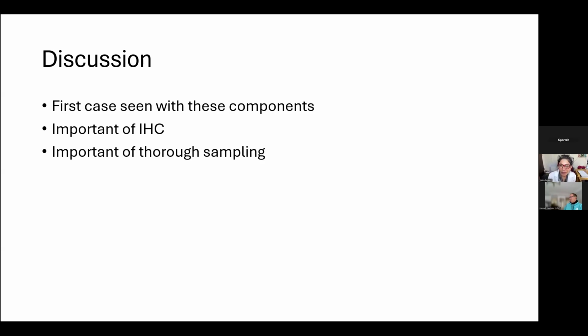Yeah, I'm thinking of mature cystic teratoma. If the thyroid follicles are not greater than 50%, it can still be acceptable as part of a mature cystic teratoma. And the small round cell component, I take it as just lymphoid follicles, just by morphology.